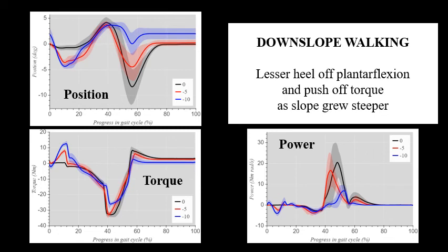Thank you very much. We hope to extend this control scheme to upslope walking and estimate stiffness and damping functions for the knee joint as well.